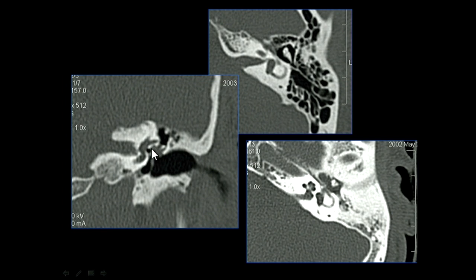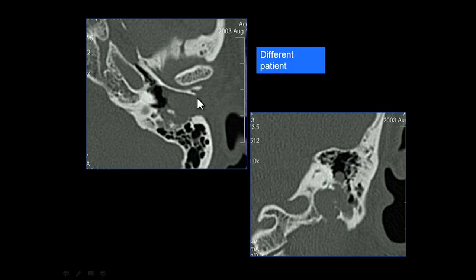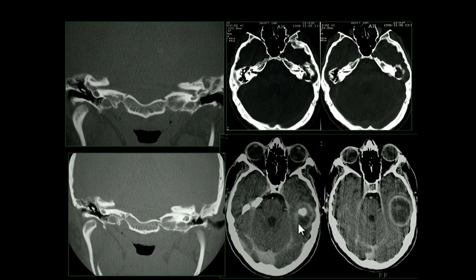There is soft tissue going close to the horizontal facial nerve canal — something you should mention to your clinician, that the soft tissue is very close to the inferior margin of the horizontal facial nerve canal. Another patient shows erosion extending into the external ear. Cholesteatoma can reach the external ear canal either from the middle ear or occasionally arise de novo within the external auditory canal. Another patient shows soft tissue with abscess formation in the temporal fossa — an intracranial complication of cholesteatoma.